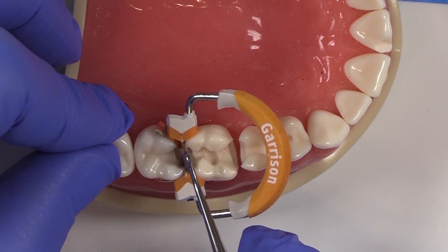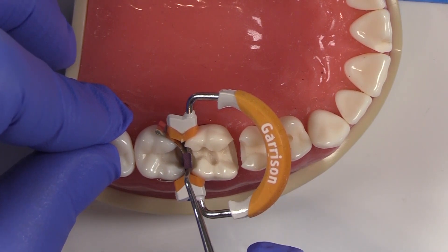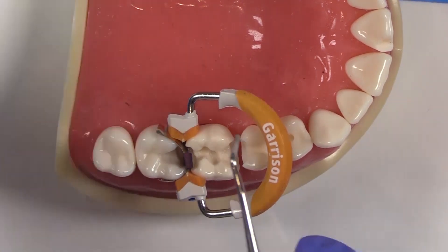If I could close this area up right here, there are a lot of different techniques for doing that. But the easiest, most straightforward, and most efficient way for me is to take some Teflon tape, roll it up into a little ball, and pack it in there. It will give just the right amount of tension to make the matrix band adapt perfectly in that area.